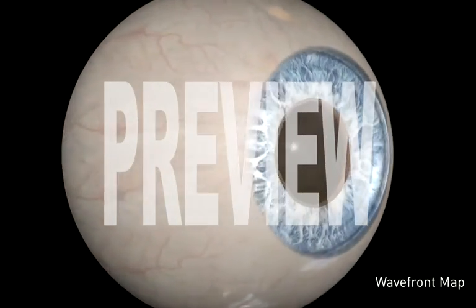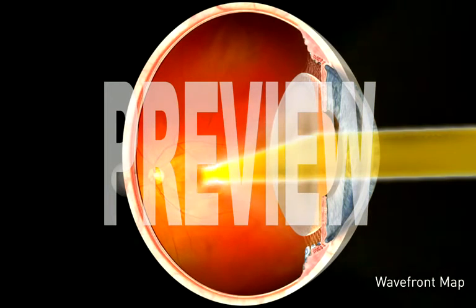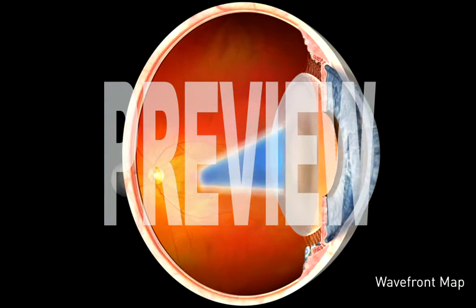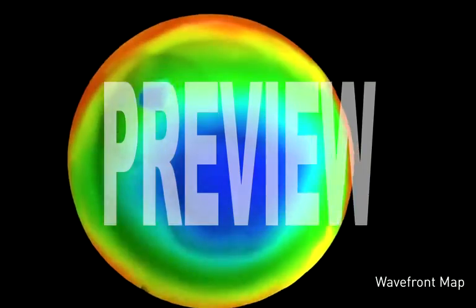To create a map of your eye's optical system, flat waves of light are passed through the entire eye and reflected back to a wavefront measuring device. This device converts the reflected light into a 3D map, representing your eye's unique visual distortions.